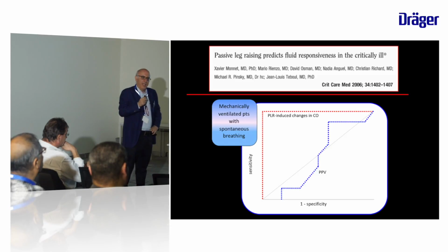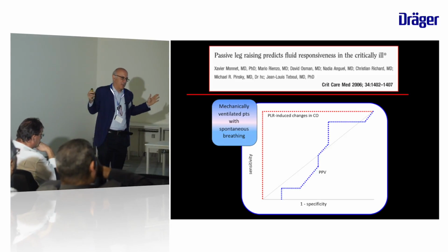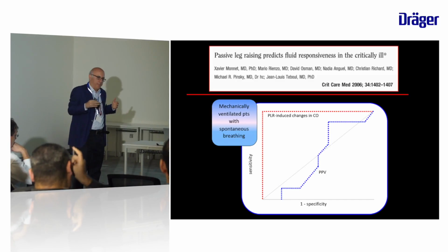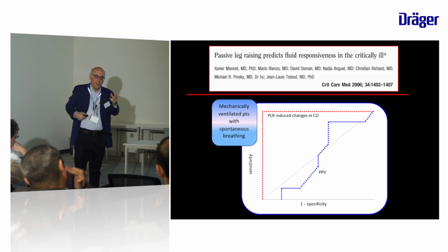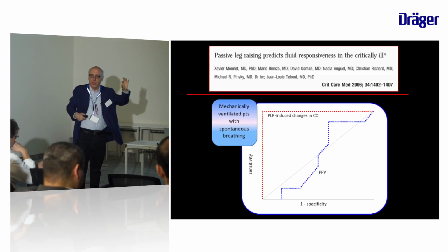So to conclude here, I think that if you have all the possible perfect patients, you can use the PPV or stroke volume variation. But if you have low tidal volume, one possibility is to use the end expiratory occlusion maneuver, but better to use the end inspiratory and then expiratory occlusion at low tidal volume, or to increase the tidal volume, okay?